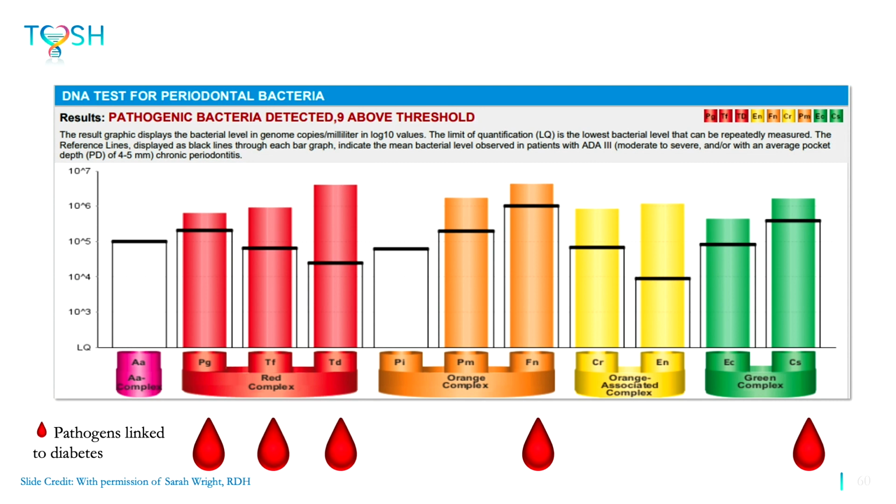She also had 9 of the 11, not the exact same 9, but all 5 of the pathogens that are related to diabetes this woman had. So definitely made sense why all of a sudden she was getting a lot of bone loss. And it's interesting because some patients will have just one major vertical defect or a certain area that all of a sudden gets recession, but it doesn't always affect the entire mouth. Rest assured, these infections are in the entire mouth, whether it's a 2-millimeter pocket or a 10-millimeter pocket. The bacteria doesn't really care if we do scaling and root planing on 1 to 3 teeth. It's not going to say, well, let me just stay over there now.